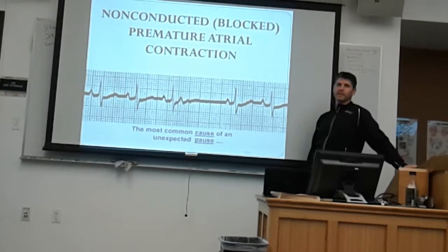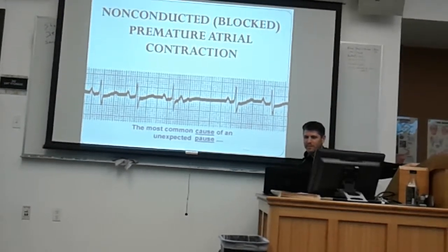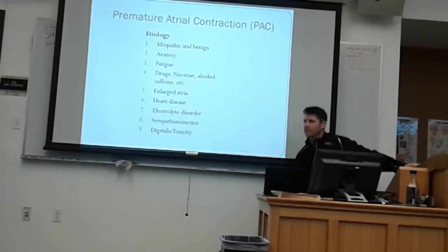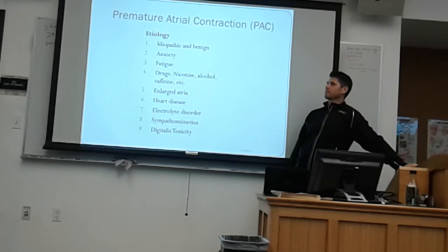Good on the PACs? No? Why not? I don't get it. Let's talk a little bit more after this. Let's make sure you get those. We'll come back and I'll draw it in just a minute.